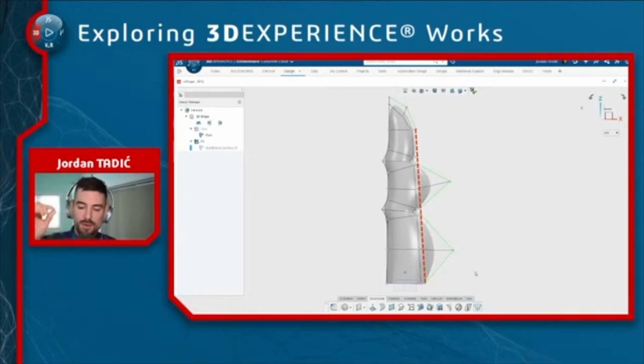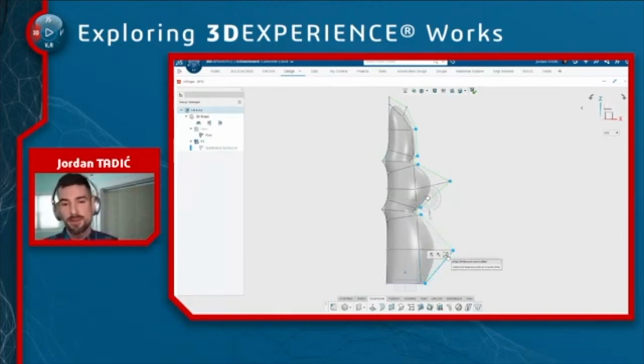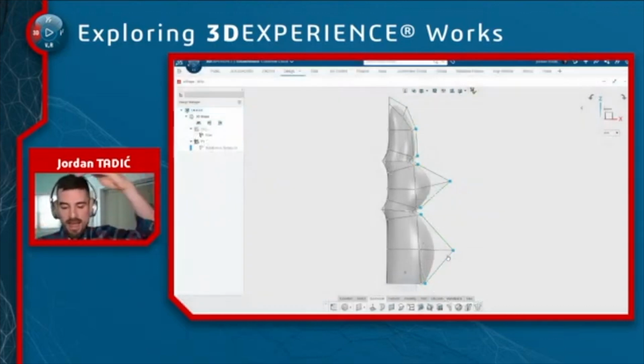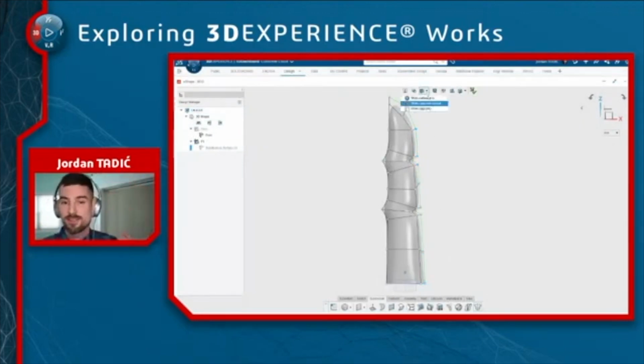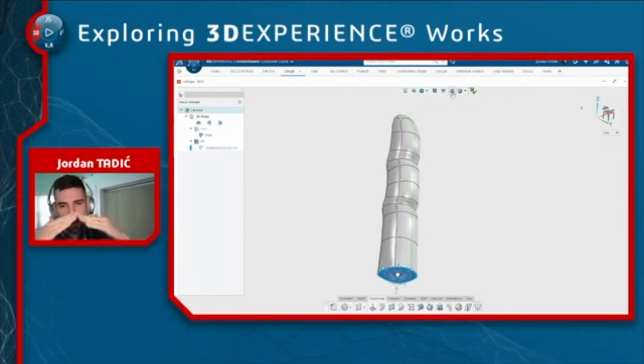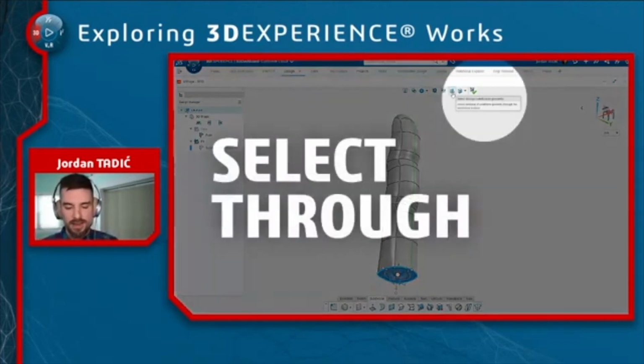And what you want to do is pick the 2 points first that are going to define that theoretical line. And then you can control select the rest of the geometry, whether by box selecting or individually selecting. On the context menu, you'll get the option to align vertices to each other. What it does is it looks at the first 2 selected points, creates a theoretical line, and flattens everything to that line, which is a super easy way to handle those times when the cage is inverted and you want it to be perfectly flat. You can pick those points and flatten it out very, very easily.